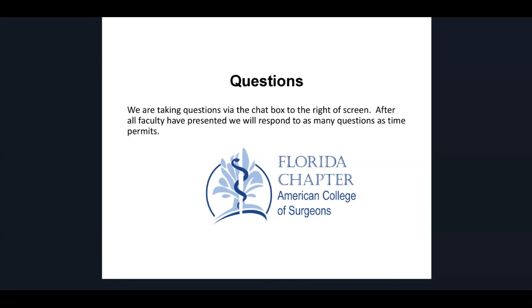With the UroNav system, do you speculate the next generation will allow for tumor resection under live imaging? Well, it's interesting, actually. There are multiple different systems besides the UroNav. There's the Artemis, and a whole slew of new machines have entered the market over the past 2 to 3 years to allow MRI fusion technologies.